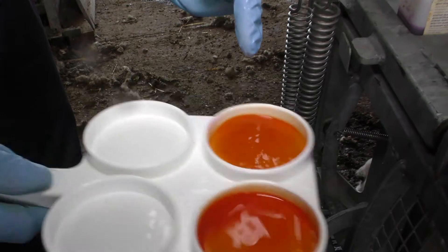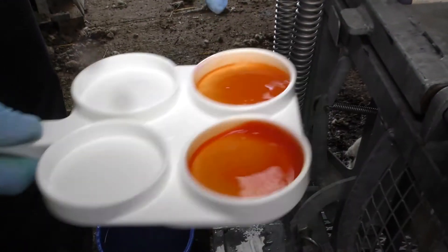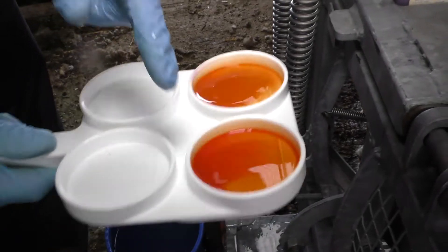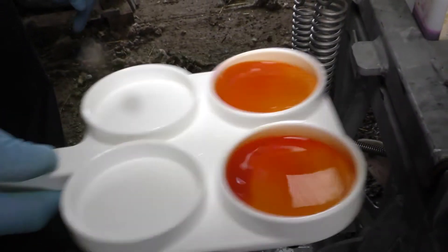When I'm swirling around you can see this side gravitating towards the middle of the tray, and you can tell that that's a three. And this one here consistently staying almost exactly the same as the original consistency, so that's a zero.